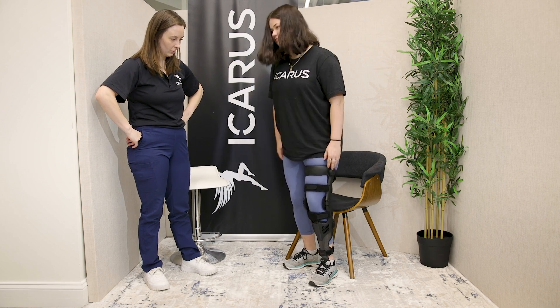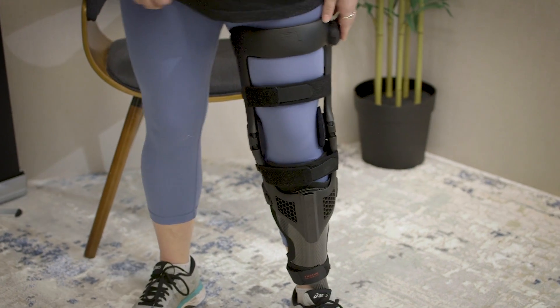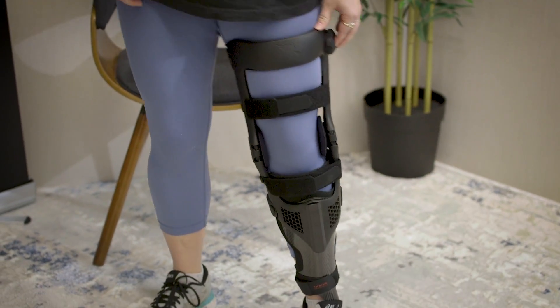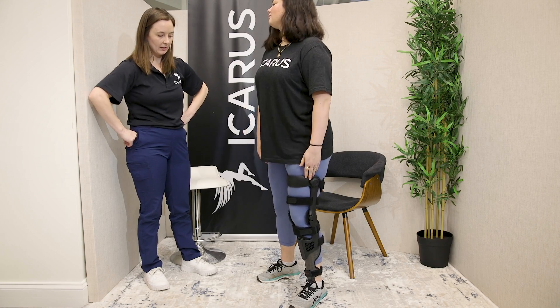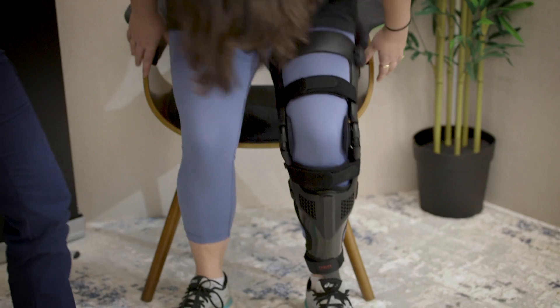Conduct a gait assessment to evaluate the KAFO's functionality. Observe the patient's walking pattern and ensure smooth and natural movement. Address any issues, such as excessive knee flexion or drop foot, by adjusting the KAFO or tensioning system accordingly.